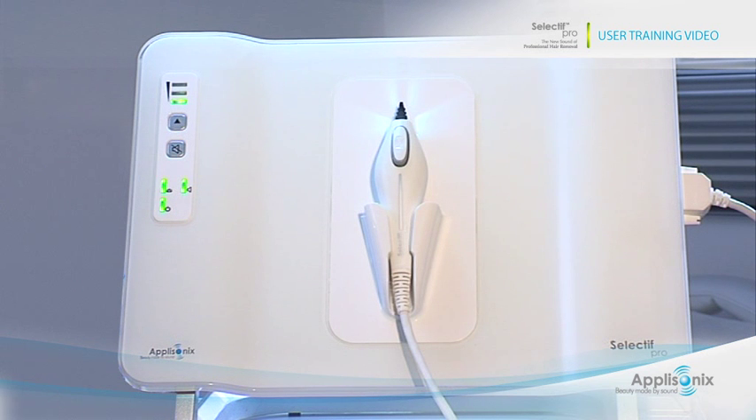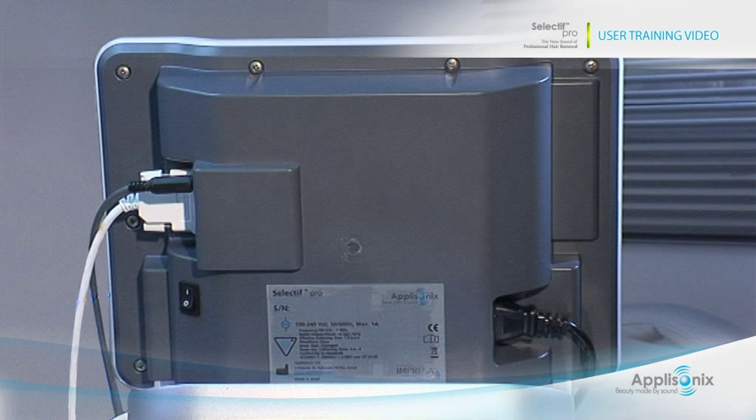In the center of the system is the probe, mounted in the probe holder. Now let's look at the back panel. This is the probe connector, D-type, the power on-off switch, and the foot pedal connector. On the other side of the back panel is the power socket.